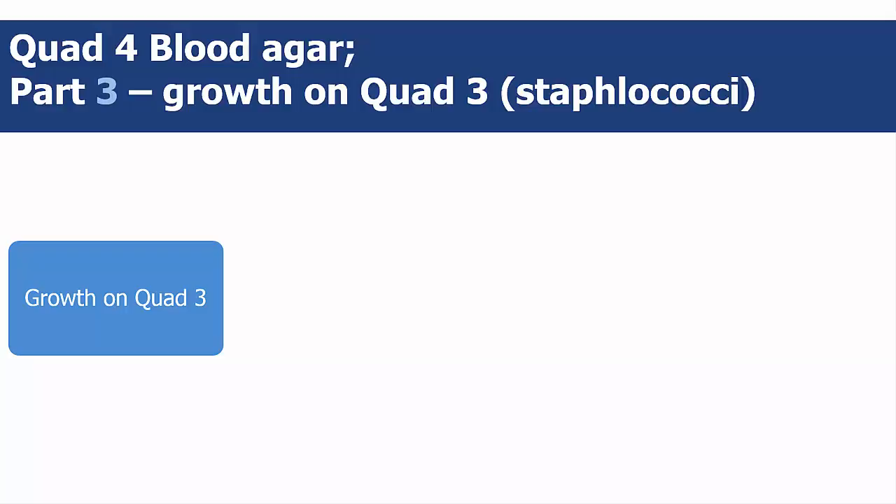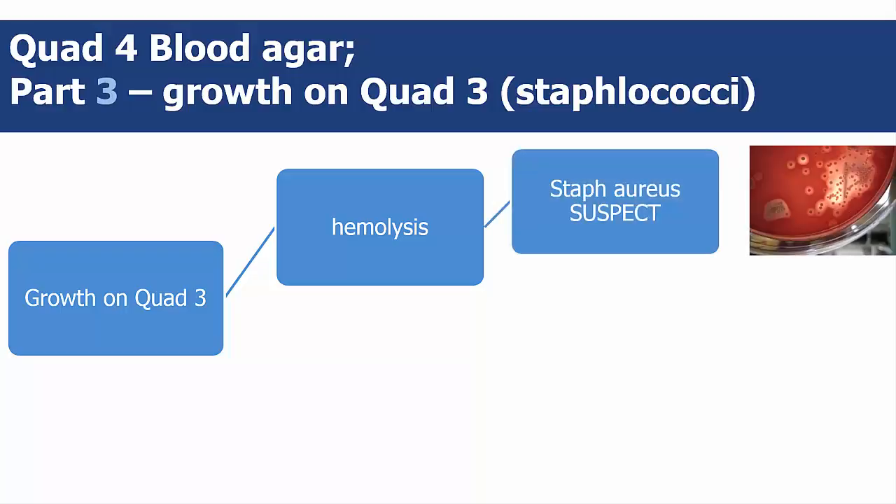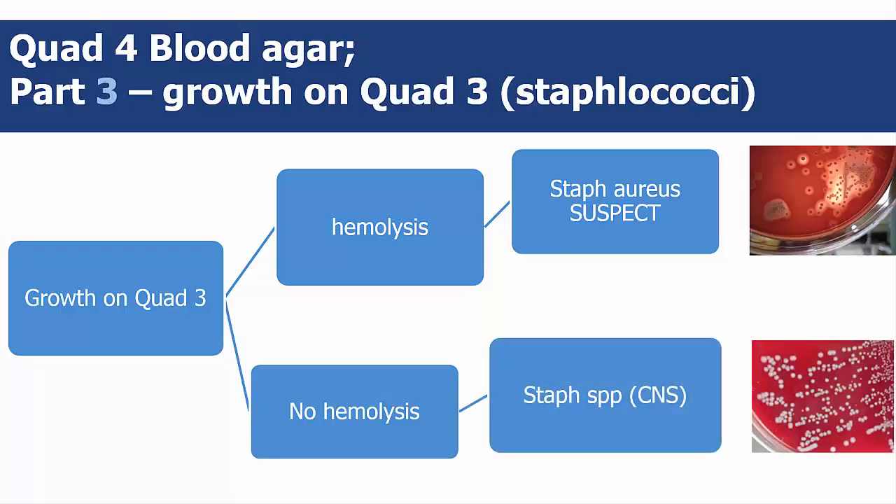If you saw colony growth on staphylococci quad 3, you should also see growth on blood quad 4. Hemolysis around larger white, cream, or yellow colonies indicates staph aureus suspect. No hemolysis around larger white, cream, or yellow colonies indicates staph SPP or CNS.